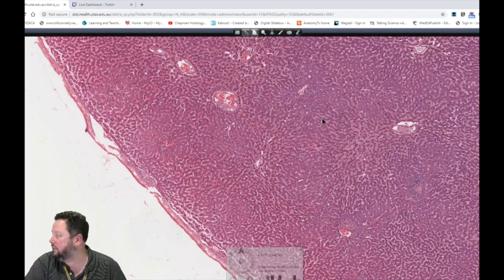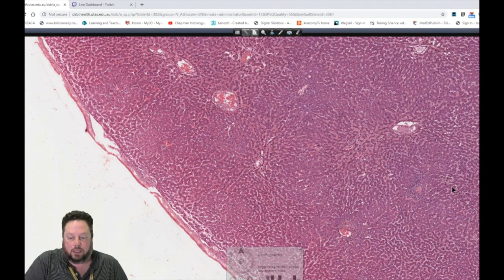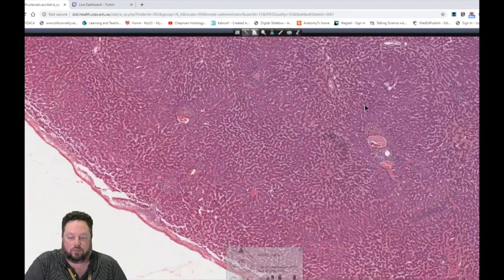So I don't know, does that sort of... Yeah, I just thought it might be interesting for people to think about the human stuff. I know, Rosalind was talking about it in the pathology shoot last week. Yeah, and I alluded to the slide of the human and I never got back to it, so thanks for reminding me.